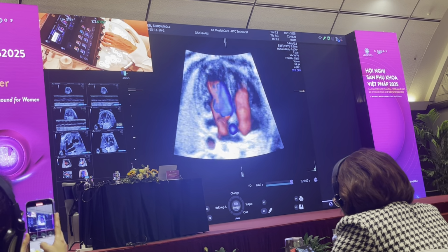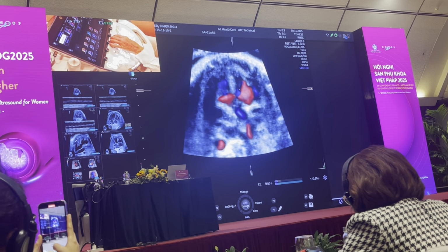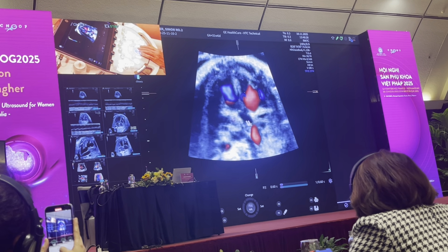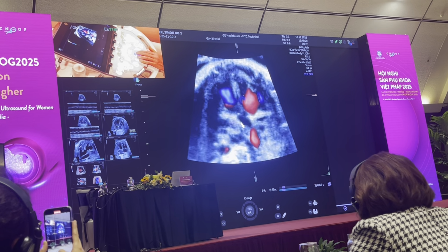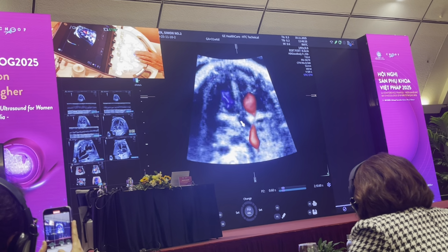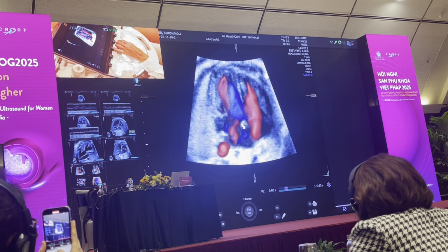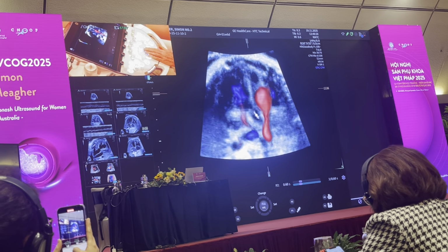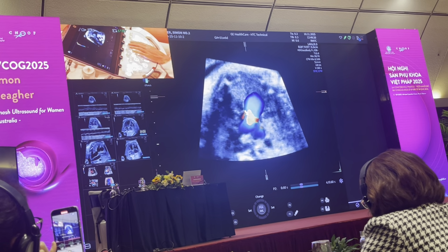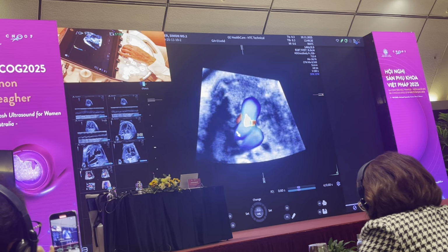But I feel that this baby has normal flow. I see the left ventricular outflow tract, and I see that there's turbulence in the left ventricular outflow tract. But I think the reason this baby shows turbulence is not because the baby has aortic stenosis, but because the baby's PRF is too low. But I need to check this, and I also do a pulse Doppler just to make sure. And then I come across, and I see that the first vessel that leaves the heart is the aorta, and then if you go higher, the pulmonary artery comes over, and the pulmonary artery crosses over the aorta. It's very important to see that as part of a normal examination.